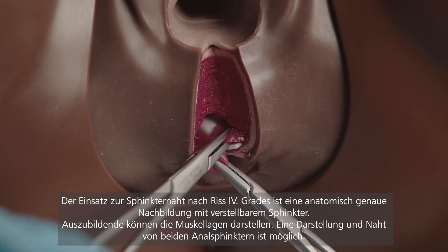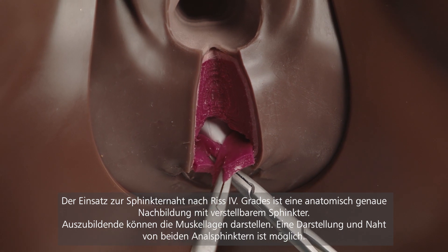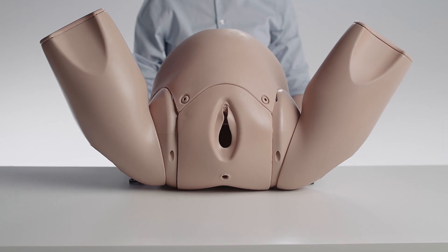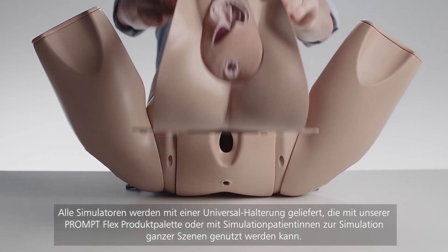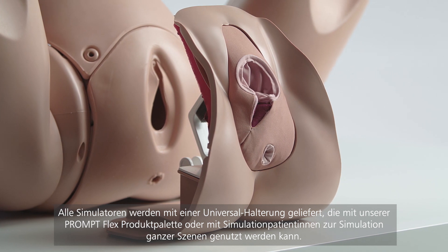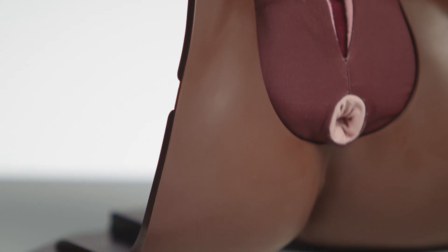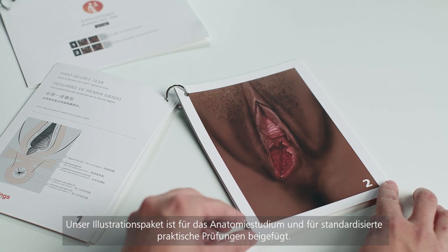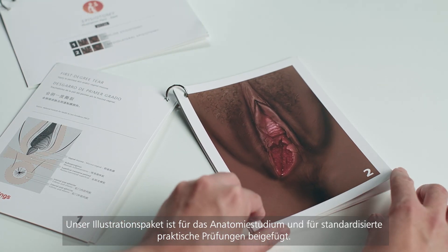Trainees can dissect the muscle layers, allowing for identification and repair of both internal and external anal sphincters. Each trainer comes with a universal stand which can be used in conjunction with Promflex or simulated patients for scenario-based training. Also included is an illustration pack to support anatomical familiarity and OSCE testing.